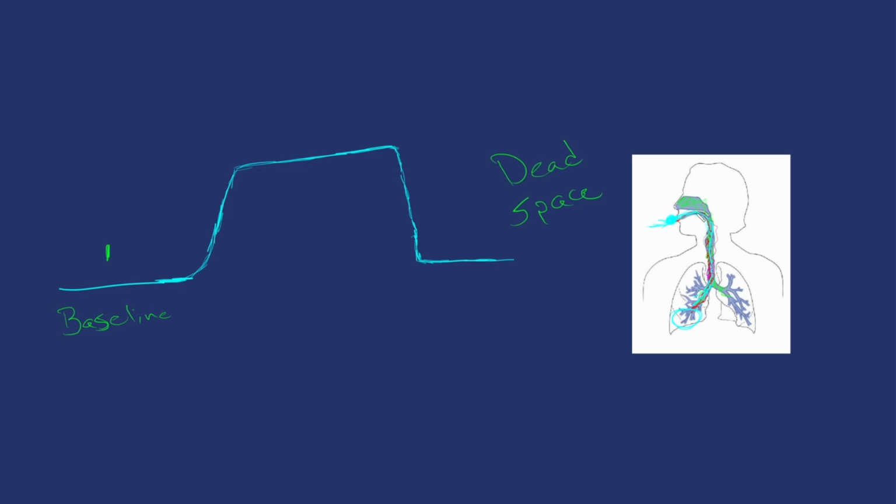Eventually it mixes up nice enough that it can come up, and we start detecting it here towards the mouth where we're reading this from. And this is going to be our stage 2, or our expiratory upstroke. Okay, and that's when the level of CO2, since our lungs are excreting the CO2, that level being detected now at our capnography meter is going to start going up.